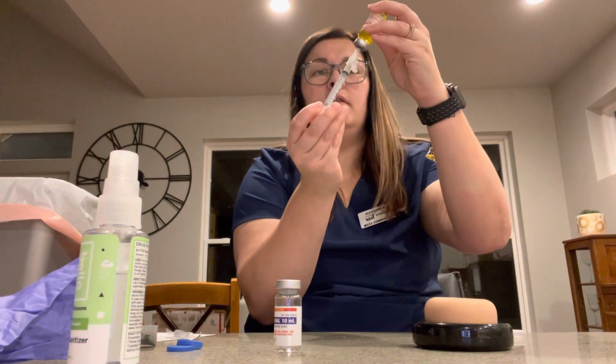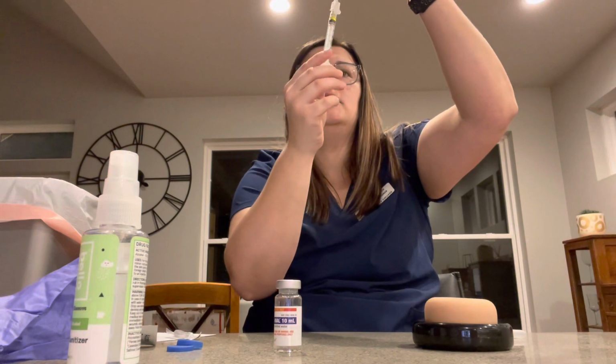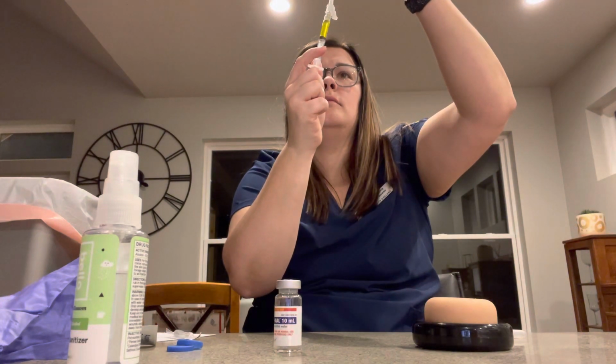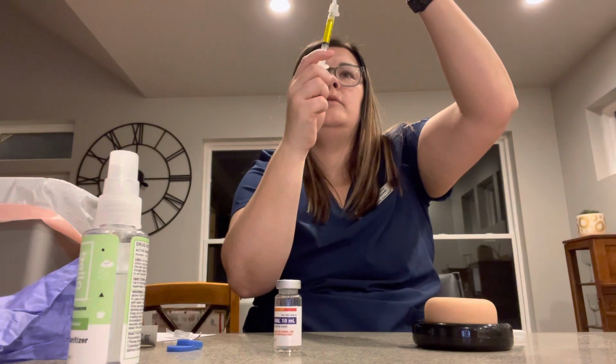I will then invert the vial, making sure to only get the medication. Which can be a bit tricky.